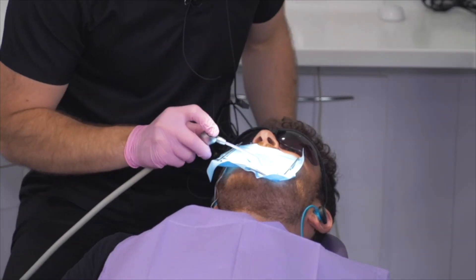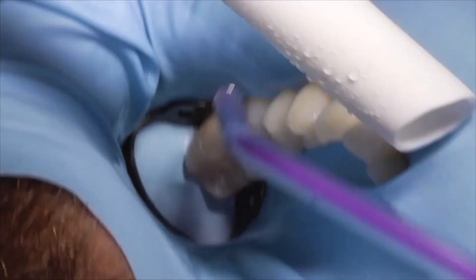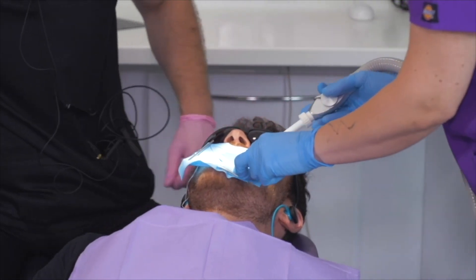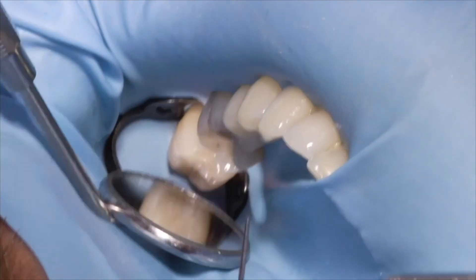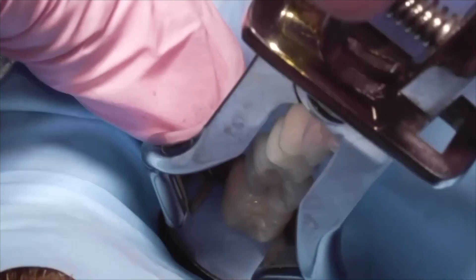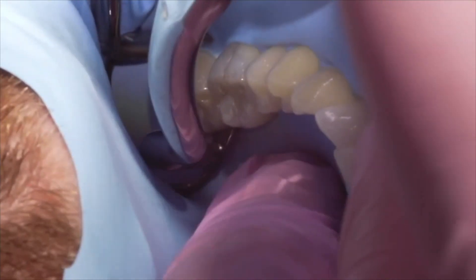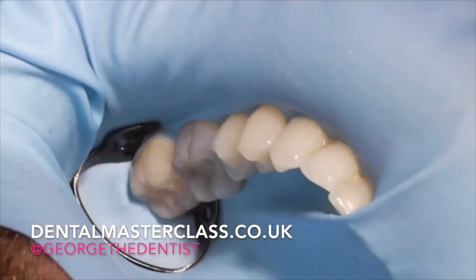Let's have suction. What I'm going to do once that's on — what you can find becomes a little bit of a problem is that it leaks a little bit underneath the clamp. So I will re-engage my clamp, disengage it on one side so it pops under, and do exactly the same on the other side. That's ready to go.